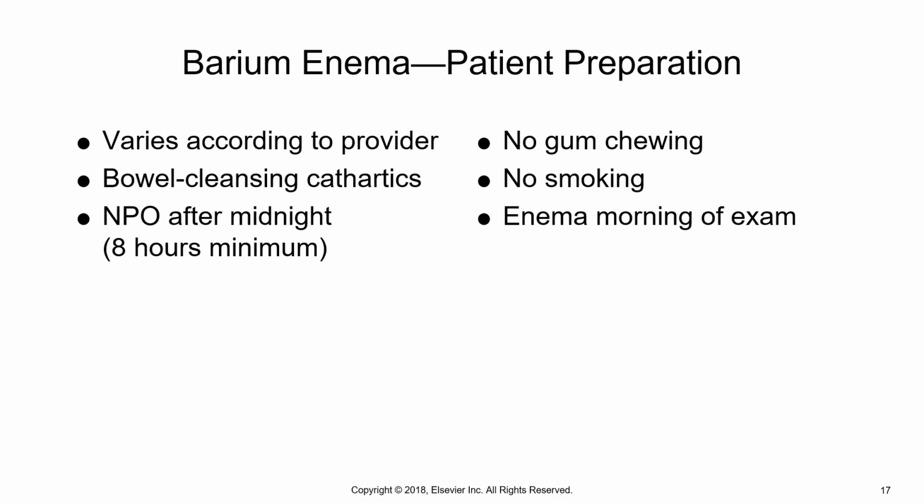So what they actually go through varies according to the provider, but it does include bowel cleansing cathartics. Cathartic is a technical term for laxatives. I will tell you that the registry loves to use that term, so make sure you're familiar with that.